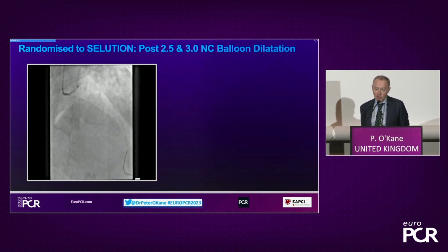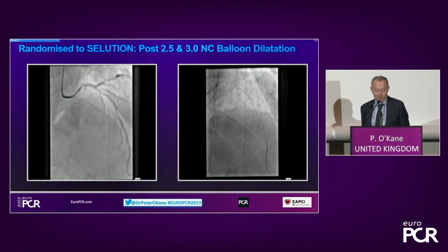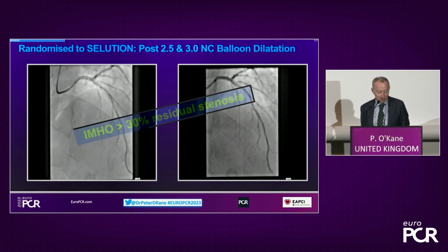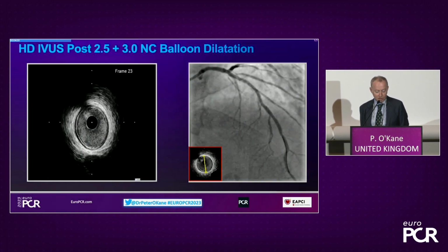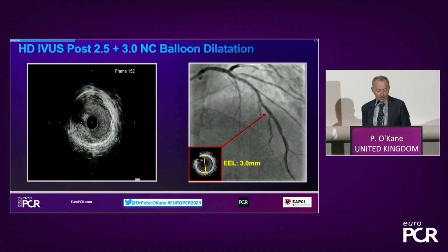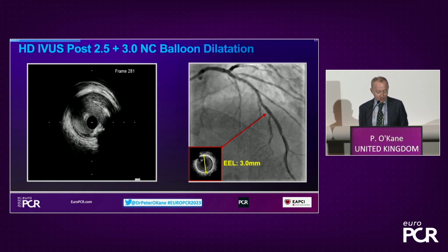Now, I guess initially when we got randomized DCB, we thought, oh, that's going to be tricky, but we're learning how to do this technique. Now, that was the angiographic image after ballooning, and I felt that this was not less than 30% stenosis, so I thought we hadn't finished at this point. But of course, I like to image during the case as well as at the start. So we're now performing some repeat IVUS.